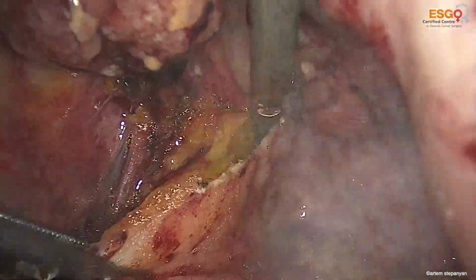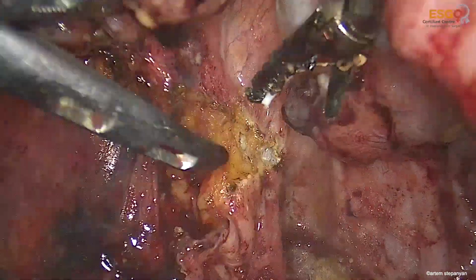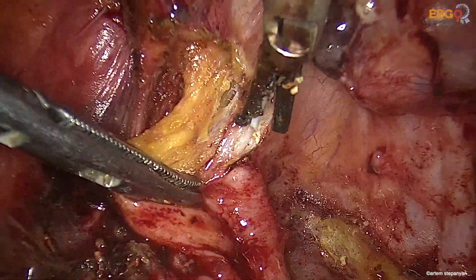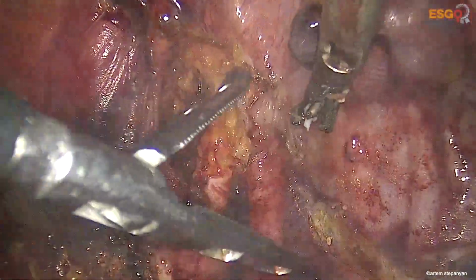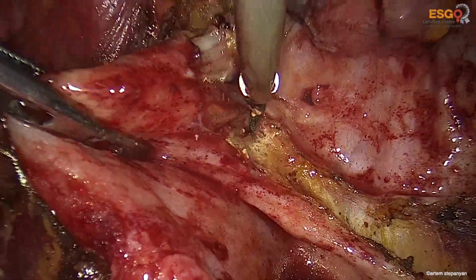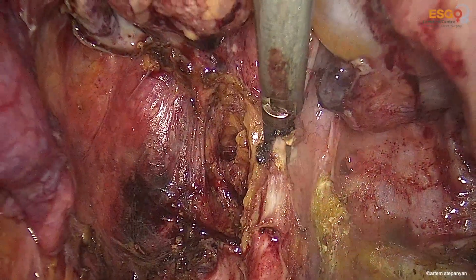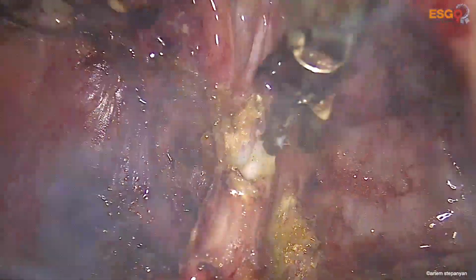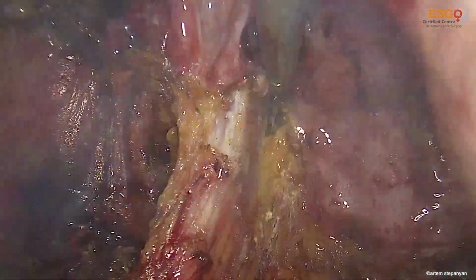And then we catch the rectum, retract the rectum ventrally and cephalad, and enter into the rectovaginal space under direct vision of the ureter. Our anatomical landmark for this dissection is the posterior wall of the vagina, or so-called Denonvilliers' fascia, which separates the mesorectum and rectum from the vagina.